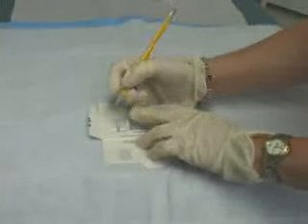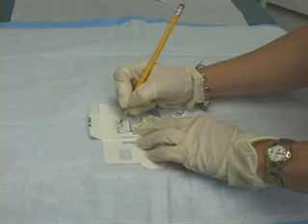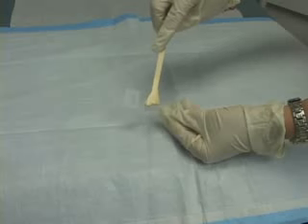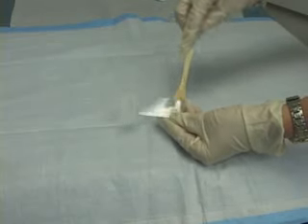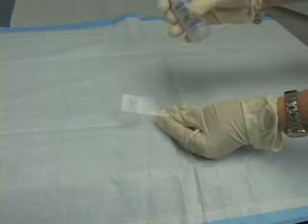Prior to spreading the cell sample on the glass slide, label the frosted end with the patient's identifying information such as name and date of birth. Do not allow the glass slide to dry prior to using fixative, as air drying will cause the cells to enlarge and make interpretation difficult or impossible.